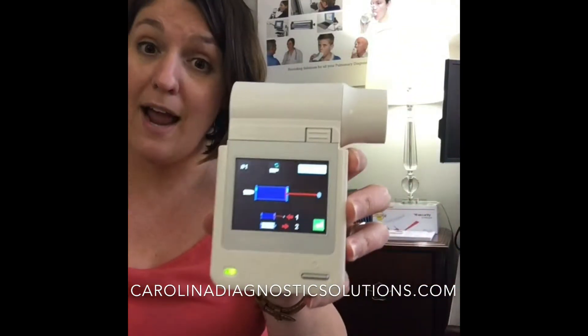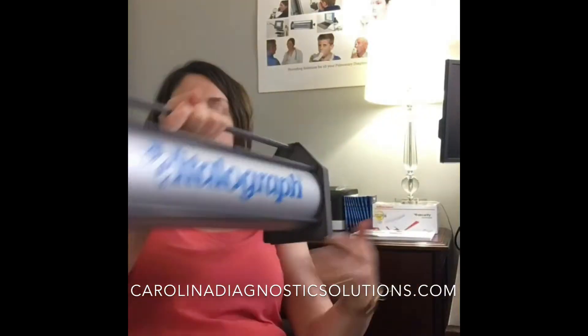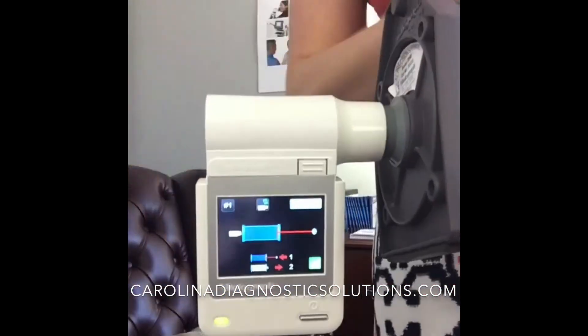From there you're going to have your device ready to go with your 3 liter syringe. I might just say my backward here. Before you put your device on the syringe, make sure that you pull out the arm all the way, as is indicated here on the screen.